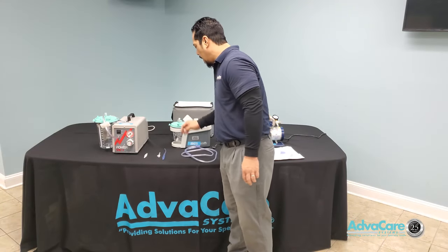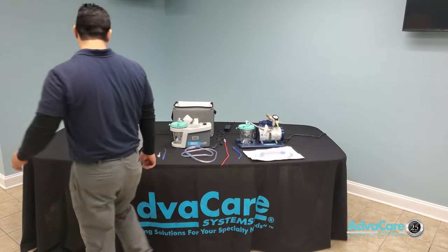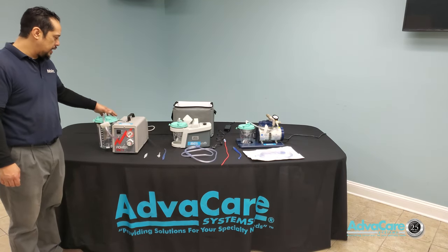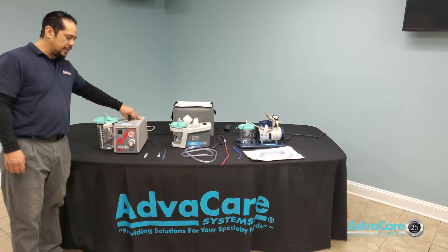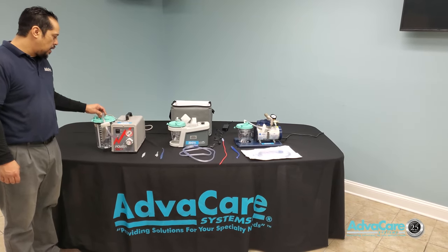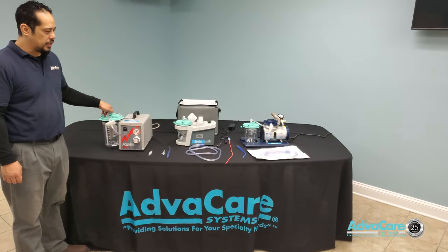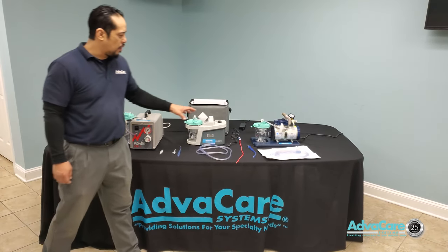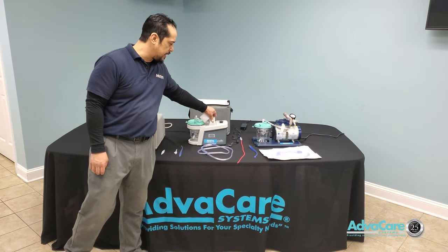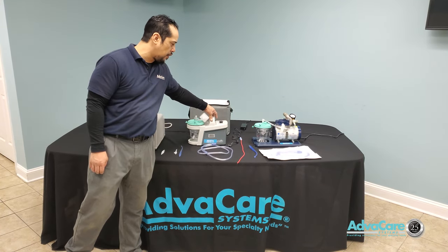Moving over to this side of the table, here is a larger machine — an intermittent suction machine, also used for gastric suctioning. Most of the time your stationary or portable suction machine will be used for oral suctioning or upper respiratory suctioning.